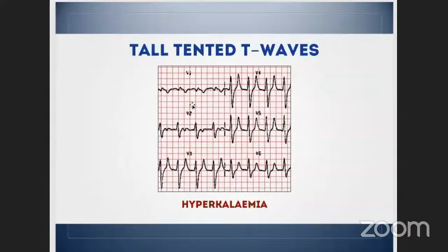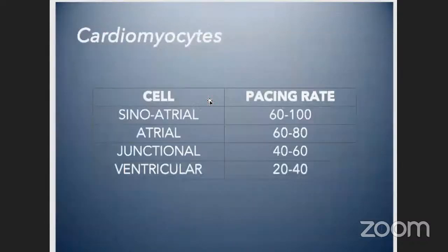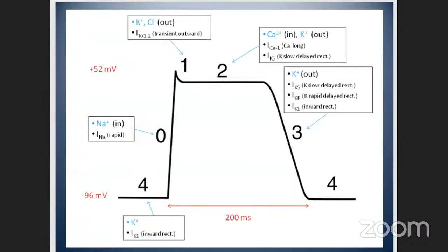And then just looking at different T waves. So we've done P wave, we've done PR, and then we've done QRS segment. And then we look at our T waves. We did also have this in our case study, and the T wave is really the most sensitive, earliest feature of any sort of changes or aberrancy in ECGs. So any sort of abnormal change with regards to that.